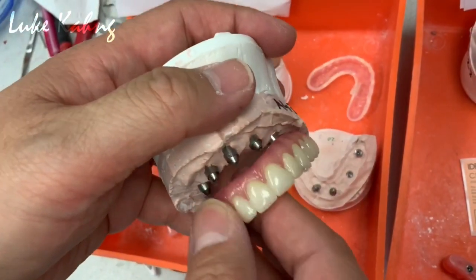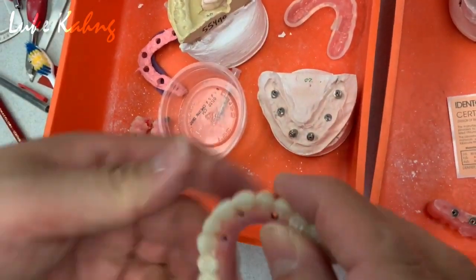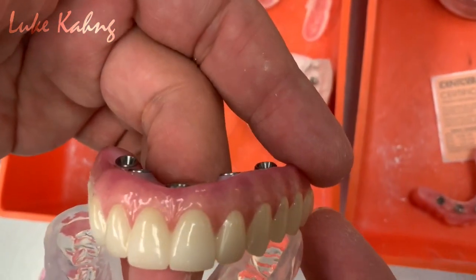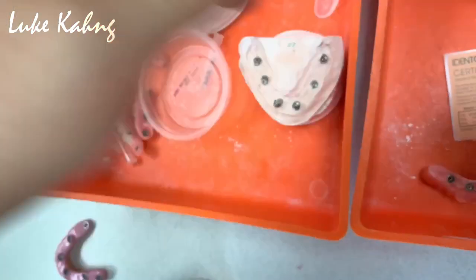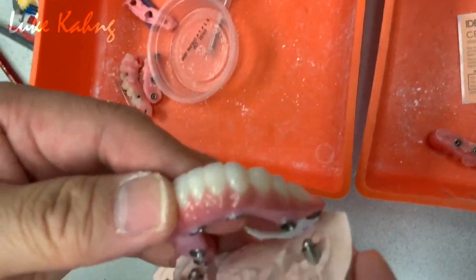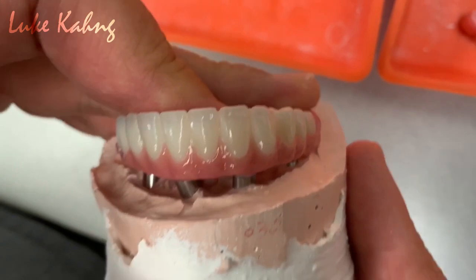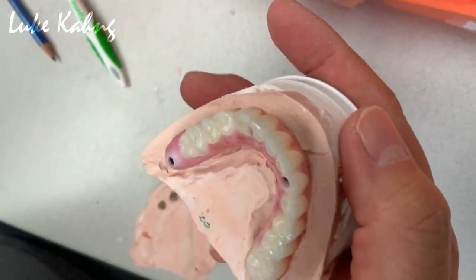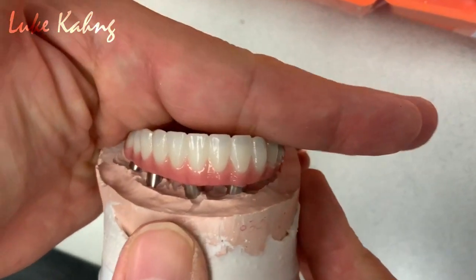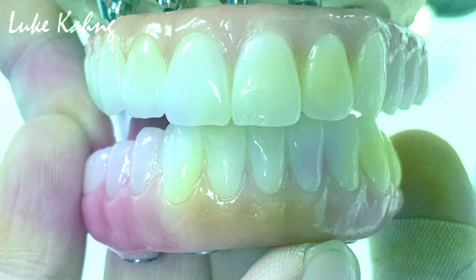All right. And we give them this one as well, so I can get the beautiful cases back. All right. The other lower case, which is the six implants. Just make sure all the way fit in. There's a closure. Great.